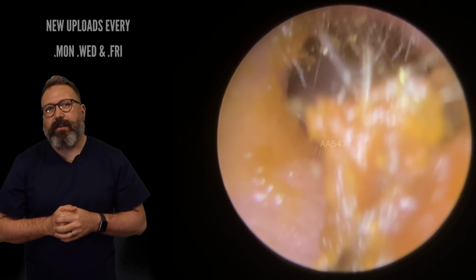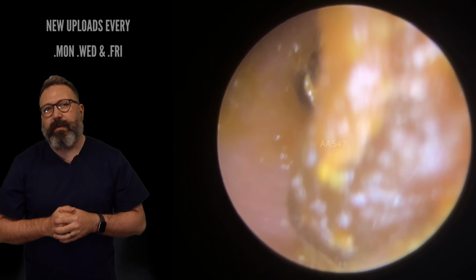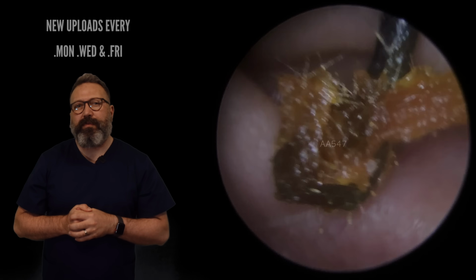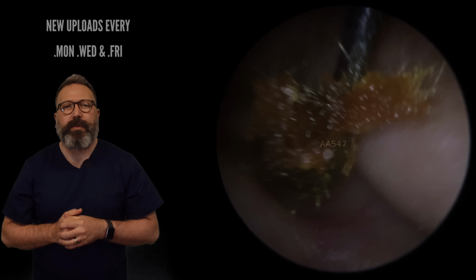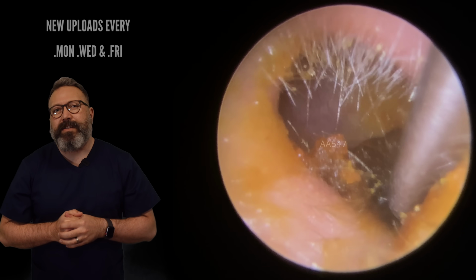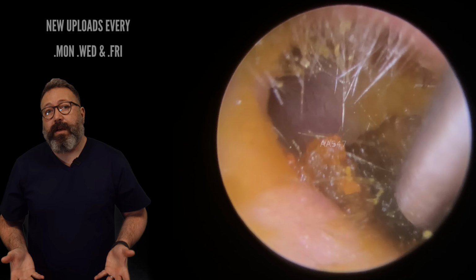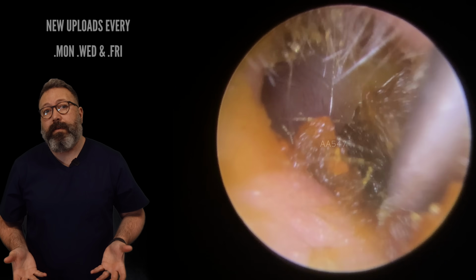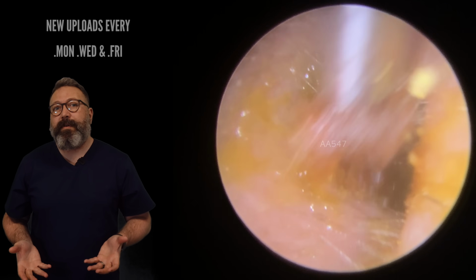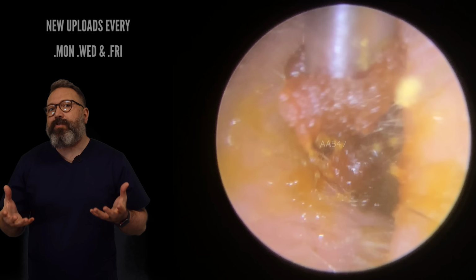Another portion of that drier wax on the outside coming away there. I'd be interested to see how much is left behind and whether we switch it up now and pop the suction tube in here. Yeah, there it is. So when it gets really thin, I tend to now lift. Now watch what happens when we lift this up. There we go, we've detached it really easily. It's become a little bit more mobile, but it is still quite sticky and tacky.